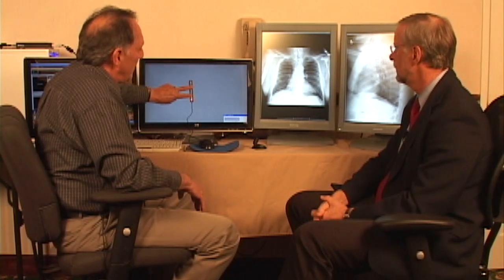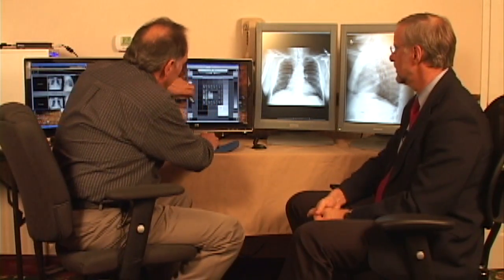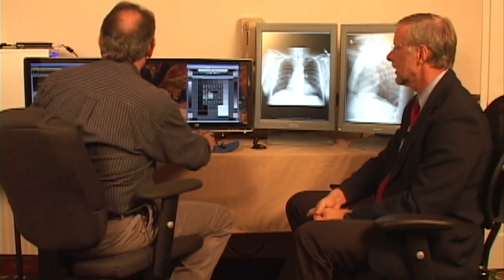So this is kind of a coarse conformance test, but it gives you a good idea of what it looks like. You can do this for all 255 steps, but you'd be sitting here holding this thing up for a few minutes. And one thing to keep in mind, anytime you're working with liquid crystal displays with a light meter, never add extra pressure to the screen, because if you put pressure on it, you squeeze the liquid crystal material out of the way and it gets brighter, and you'll distort your results dramatically. So this took only a minute or so, because there weren't that many test points.